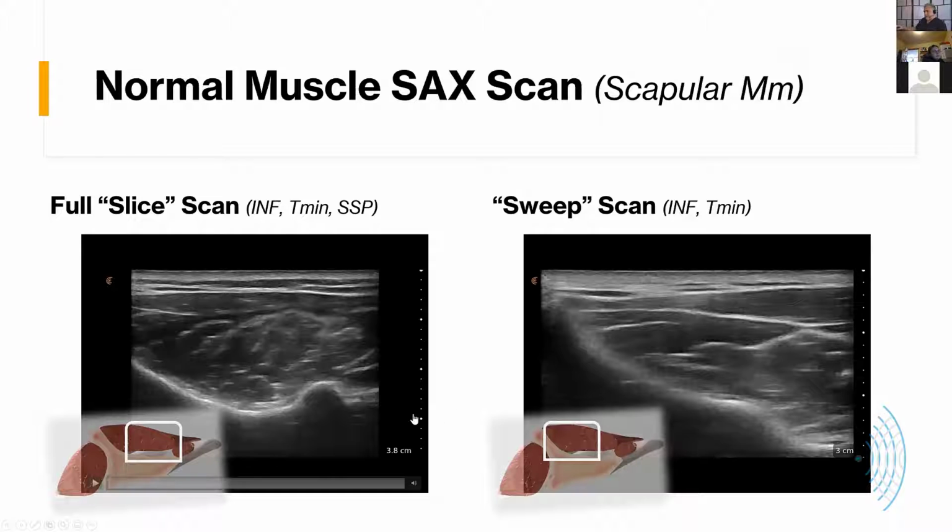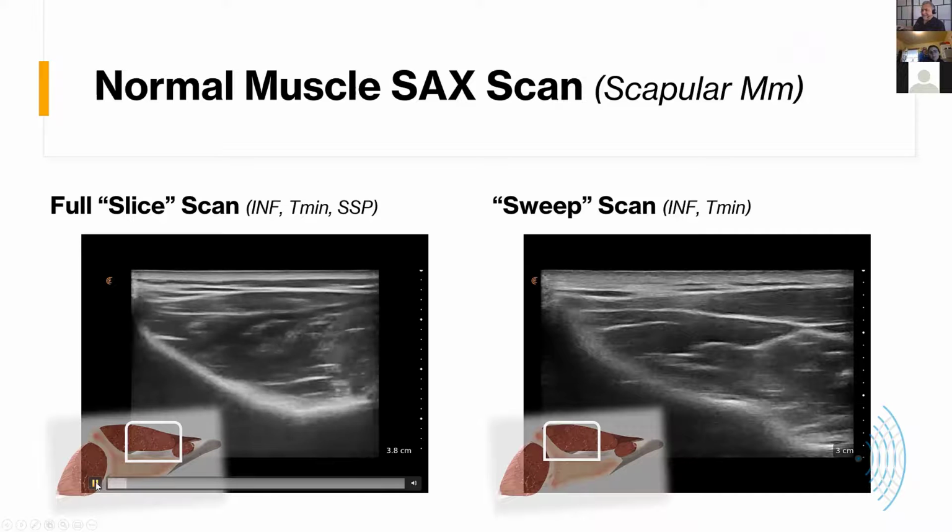Let's start doing that. Here on the left, on this particular slide, I want you to notice that where I'm indicating with my finger pointer here is the end of the scapula. And this is the infraspinatus fossa. If you take a look at the diagram to the left, the region of interest is covered in the white. So what we're looking at is infraspinatus. We're looking at the fibroadipose septae up here, and this again is bony. So I'm going to hit start. Hopefully that will start it, and it doesn't from here. Let's go to there. Good. Now you're seeing infraspinatus.